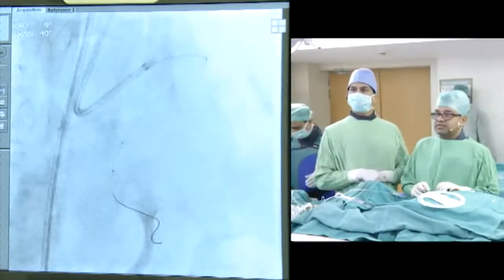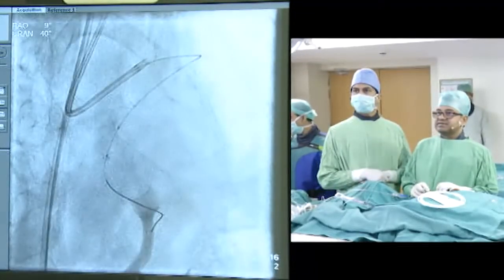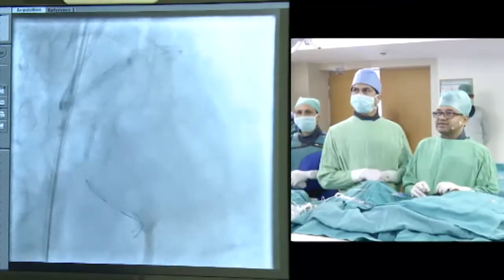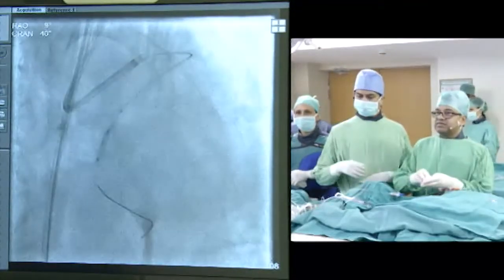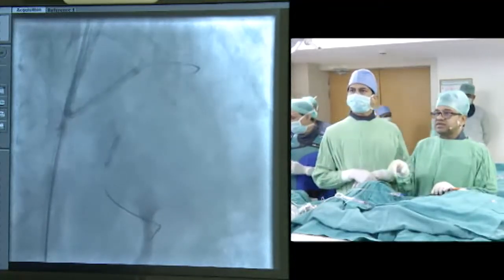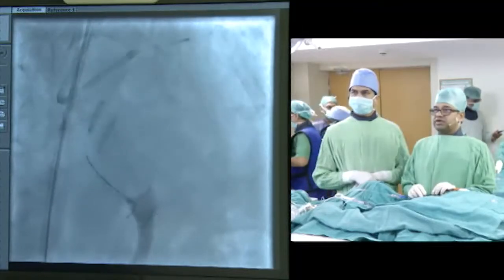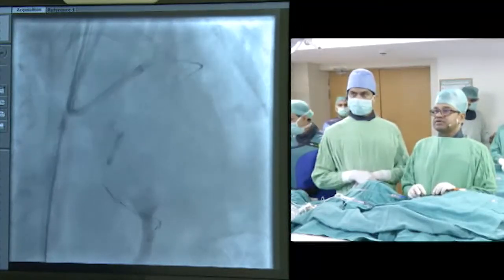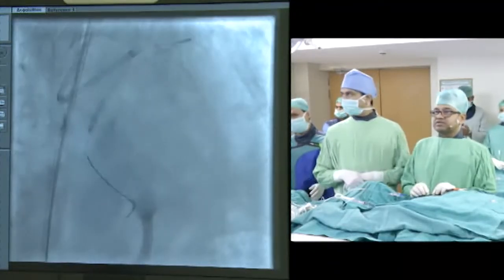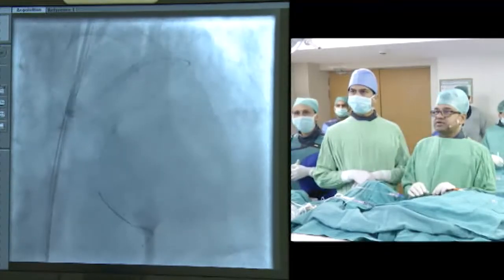In contradistinction to the Abbott product, the distal marker is, we will dilate, go up to 12. This is so much easier to see the markers. Visibility is quite good, so we can't miss all the 3 markers. So 14, 16. This is the Mosaic non-compliant balloon, 2.75 into 10. We are going at a high pressure, 20 atmospheres, and we can see good expansion. We'll dilate the whole scaffold from distal to proximal. We'll come to the proximal segment, 18, 20.